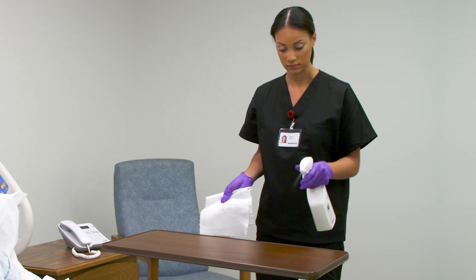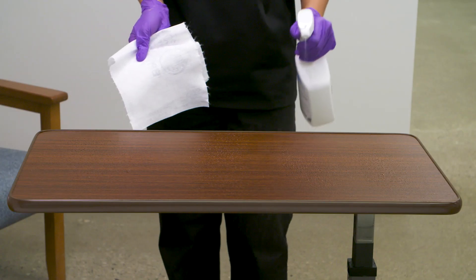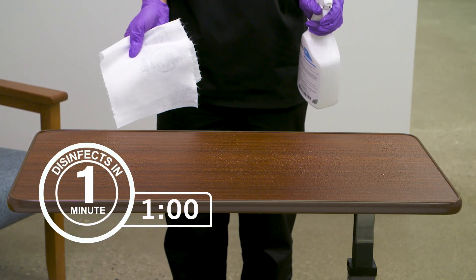To disinfect hard, non-porous surfaces, hold container 6 to 8 inches from the surface and spray. Ensure even coverage and thorough wetness. Let stand for one minute.